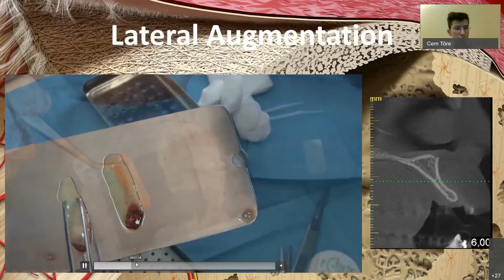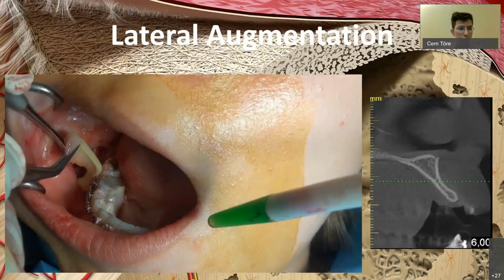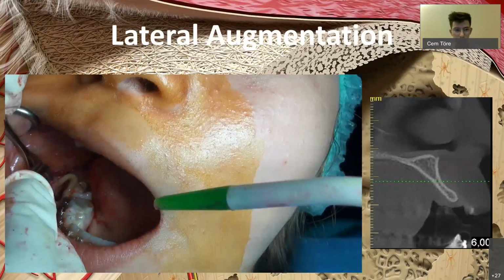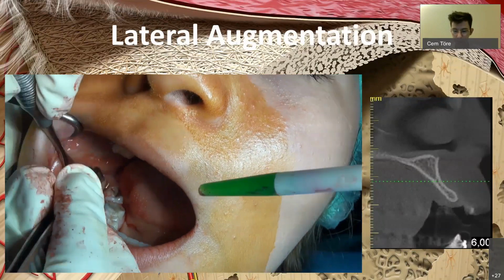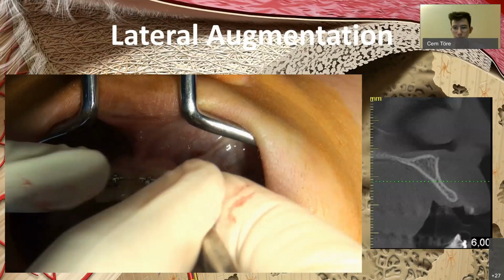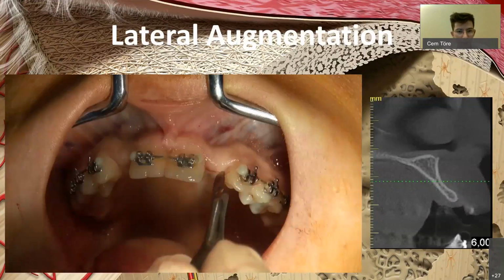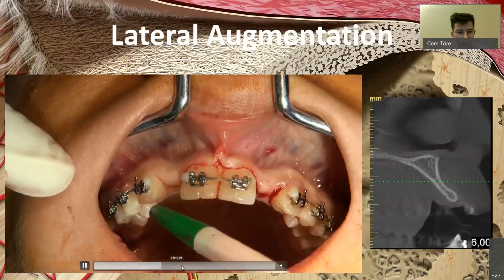Our membranes are ready. We place one of the membranes in the donor site to promote healing in that area. This is not essential. You can skip placing a PRF, but it helps with the soft tissue in the area. Now we place our initial incisions. Raise the flap.